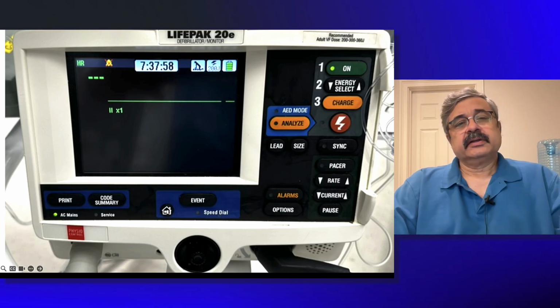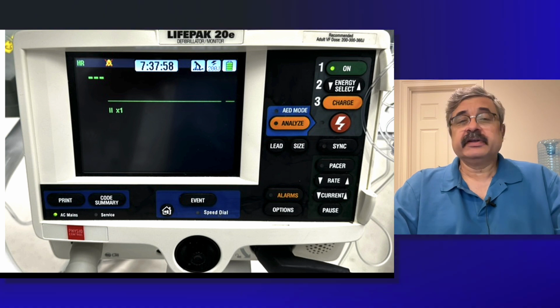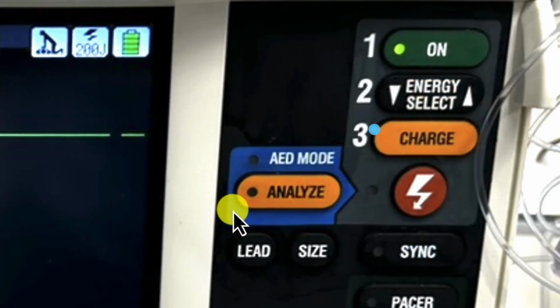So in this short lesson, we will be going over this piece of equipment which is present in all the heart rooms as well as Carbon 17, 22 hybrid rooms and OR19. Now this specific monitor, as this panel indicates, is used for internal as well as external cardioversion, defibrillation and pacing.